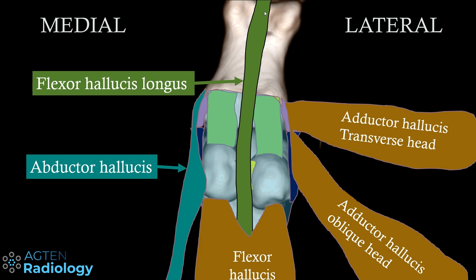The flexor hallucis longus tendon runs down here, and we have the flexor hallucis brevis with its two insertions on the corresponding sesamoid bones. On the medial aspect, the abductor hallucis blends in with all the structures, especially at the medial base of the proximal phalanx, with some fibers also going to the joint capsule and sesamoids. On the lateral aspect, the adductor hallucis muscles — with the transverse head and oblique head — are present, though I won't cover these muscular structures in detail today, as the focus is on the ligamentous structures.